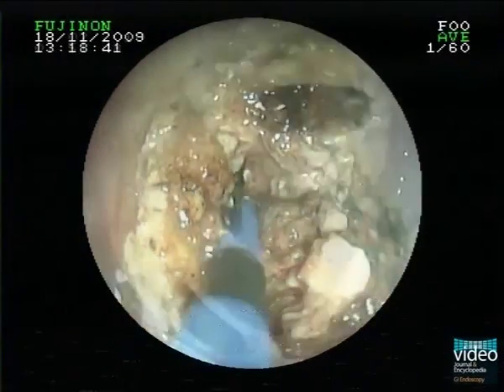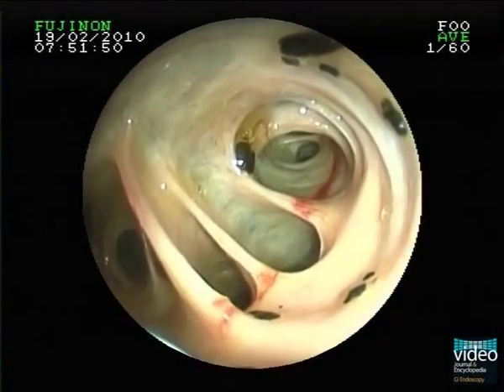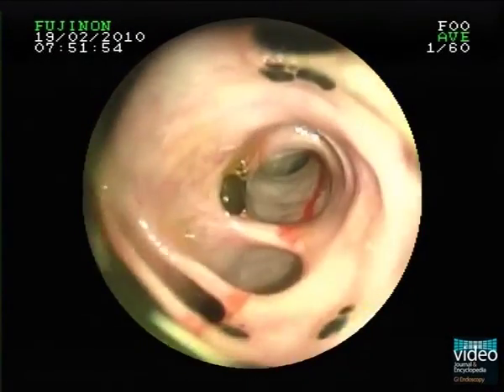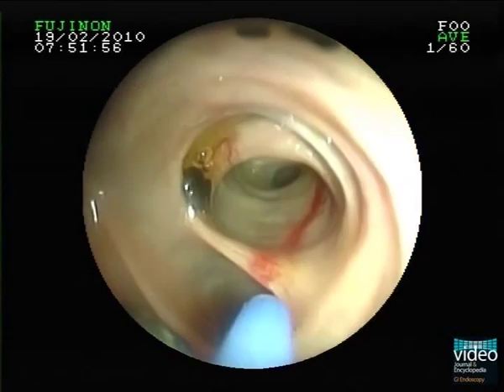Here we have already advanced the endoscope into the right hepatic duct, proximal of the neoplasia. You can see that chronic obstruction led to the formation of these small black stones.